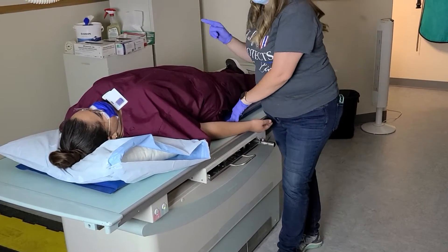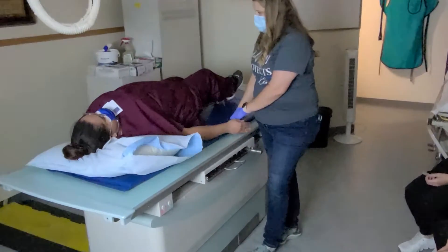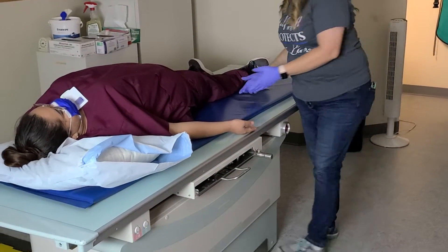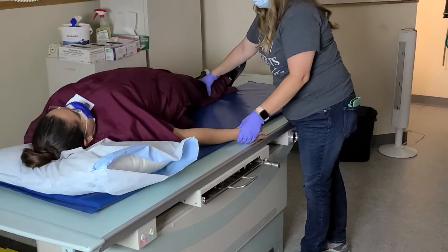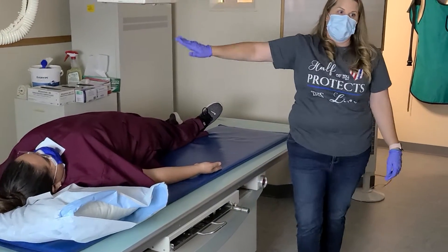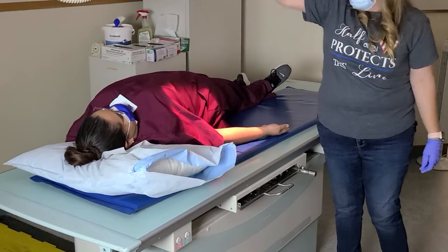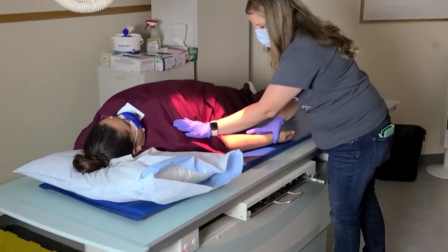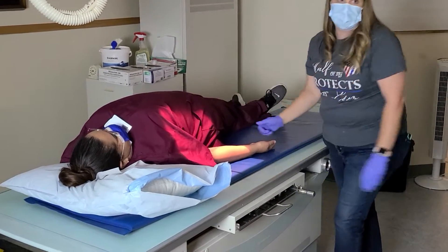So first, I'm going to have you scoot your whole body to the left. You're going to diagonal them — scoot your hips just a little bit more; it feels like you're going to fall off, but just don't fall off. You have to scoot them way over in order to get the humerus in the middle of the table. Now the arm is more in the same plane — do you see how now it's in the same plane?